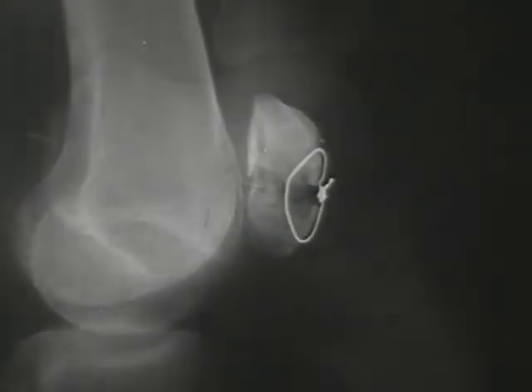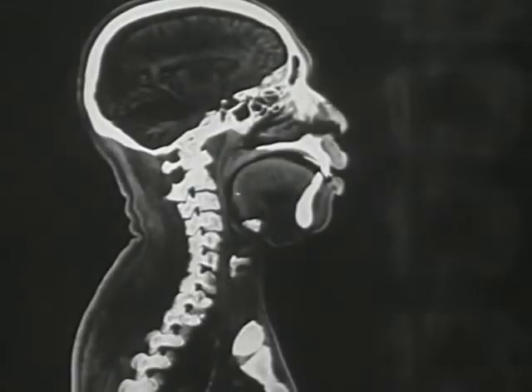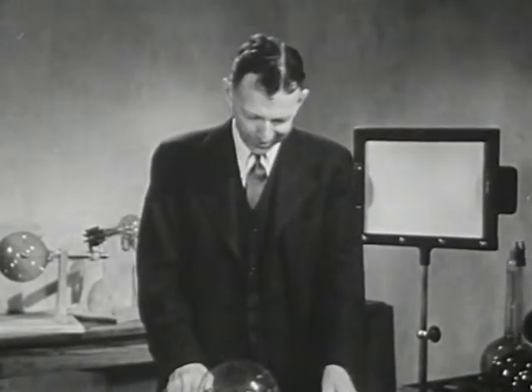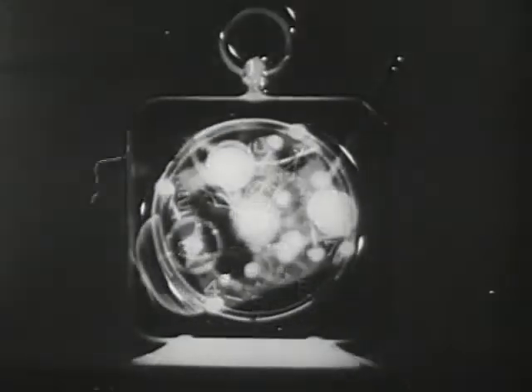In other words, X-rays pass through some substances more easily than through others, and the details of the image depend upon the amount of X-ray getting through the different substances which make up the object. It is this ability of X-rays to differentiate between types of substances which gives the rays their great diagnostic value. It seems both incredible and paradoxical that rays which are themselves invisible can reveal objects which are otherwise also invisible. But that is exactly what X-rays can do.